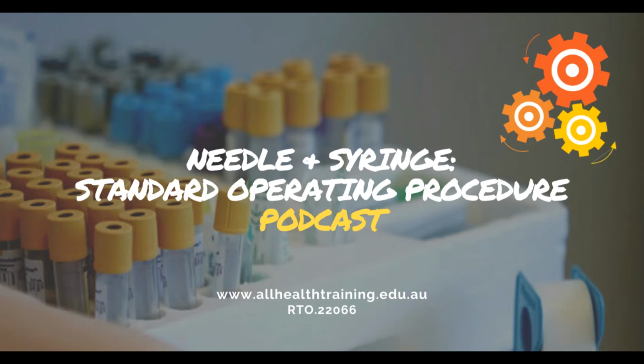Needle and syringe procedure. Start by performing your 40 to 60 second hand wash. Call your patient. Greet them in a friendly manner and tell them your name. Ask for their referral and Medicare card. Once you have looked at the test that the doctor has requested, ask them if they are happy to continue.